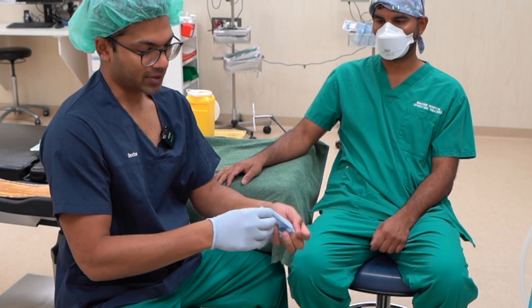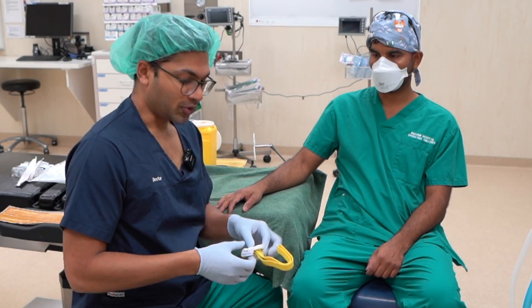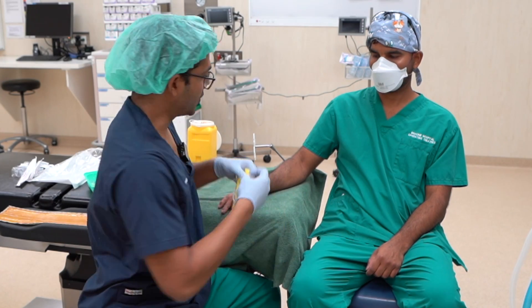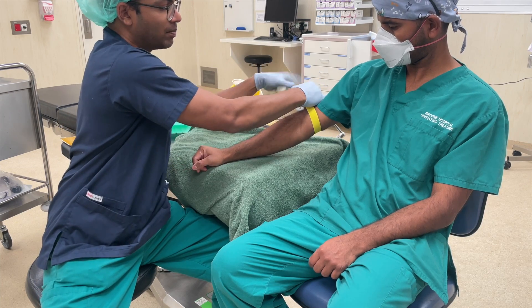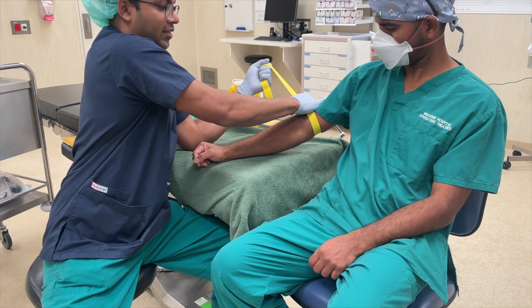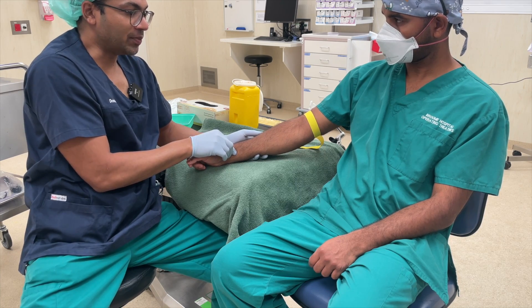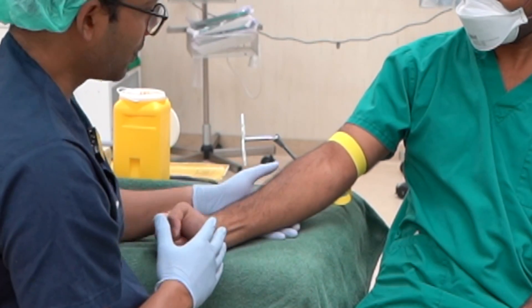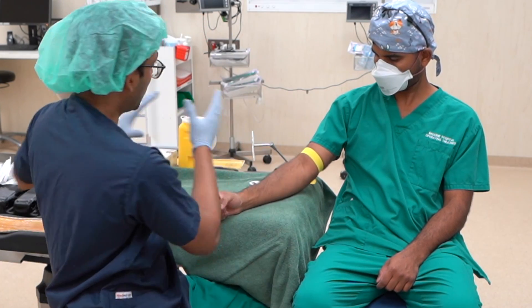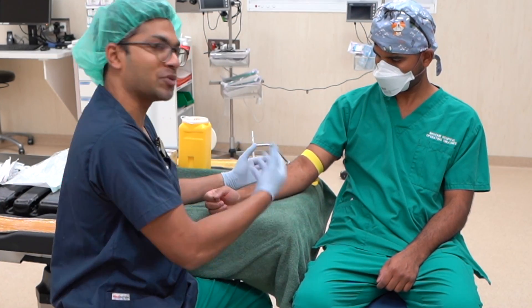I'm going to get set up and put on some gloves. Next I put on the tourniquet, using all my usual methods for making sure the vein is large — making sure it's above venous pressure but not above arterial pressure. If you're not sure, check that your patient still has a good pulse and you'll almost immediately see the veins enlarging. At this point I usually go and do my setup to allow time for venous pressure to increase.